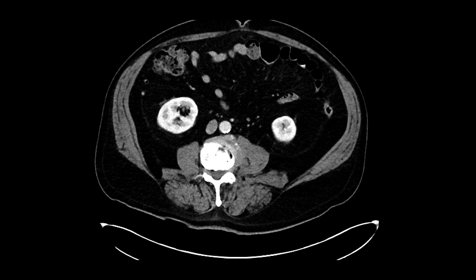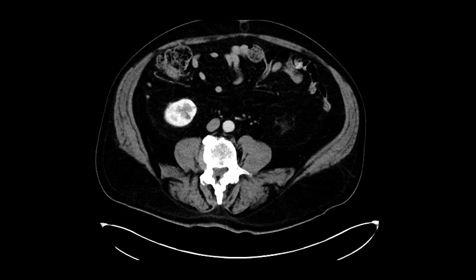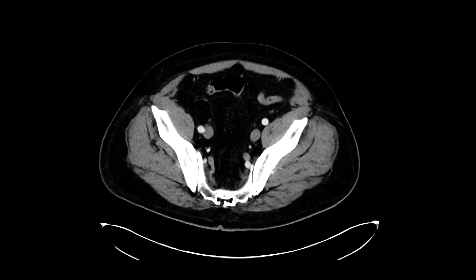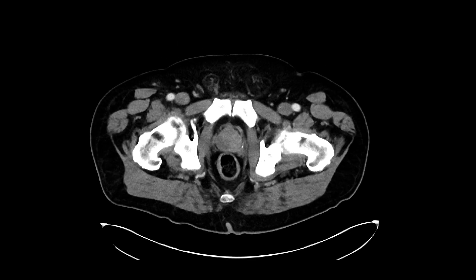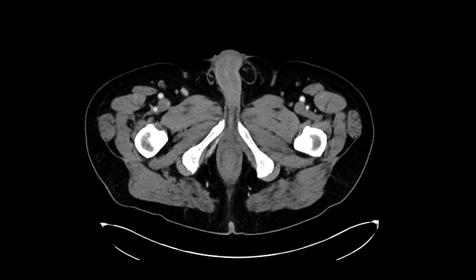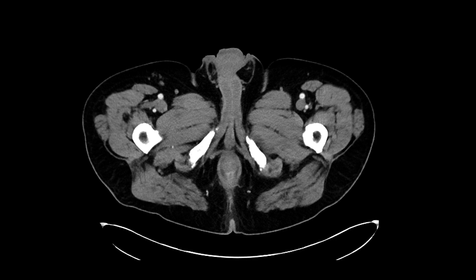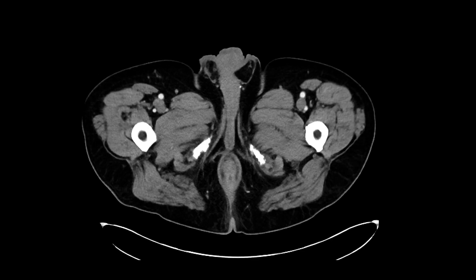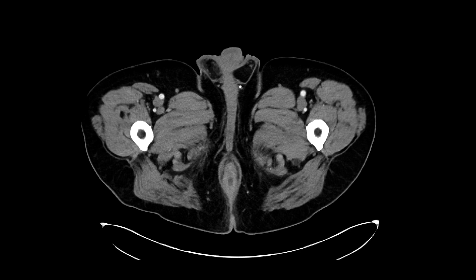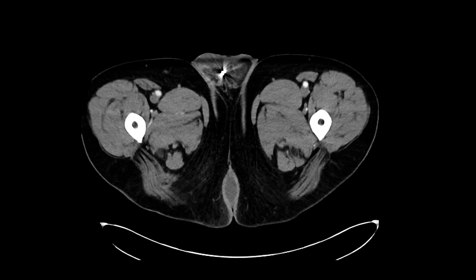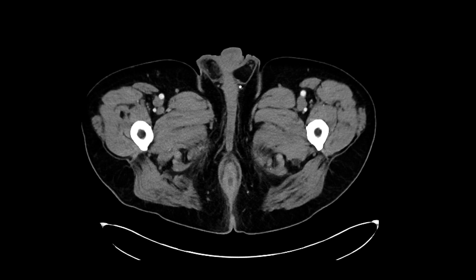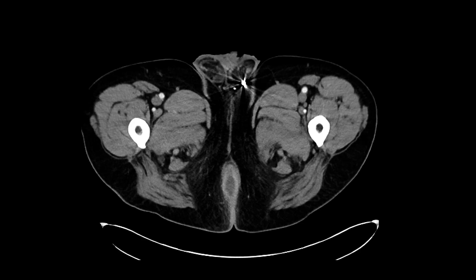This is a patient who had some perianal discomfort and they were worried about a perirectal abscess. We got the CT scan with intravenous contrast to further evaluate it. Looking downwards all the way to the rectum and to the anal region, we can see clearly there's a collection in the inner sphincteric fat going downwards, compatible with a small abscess. There may be a fistula associated with it as well.